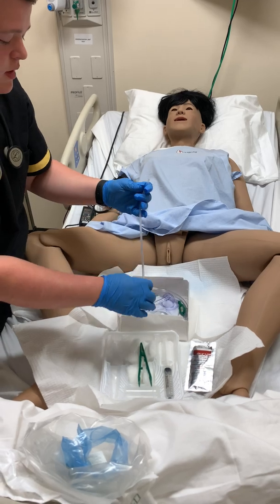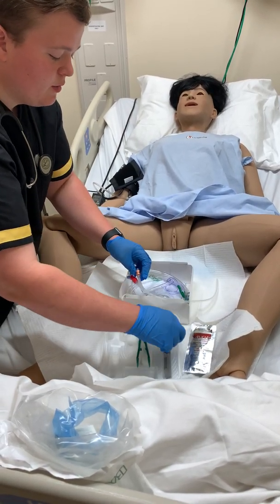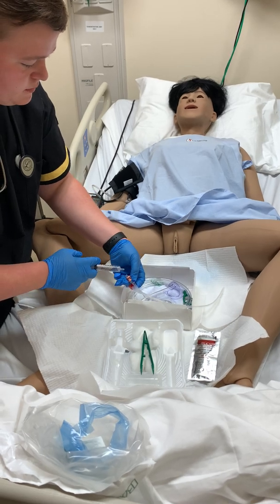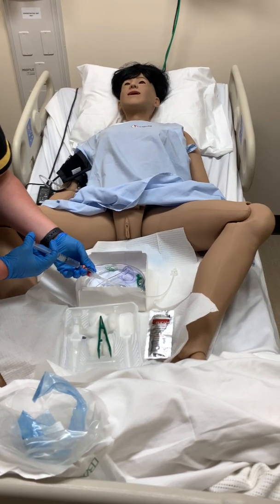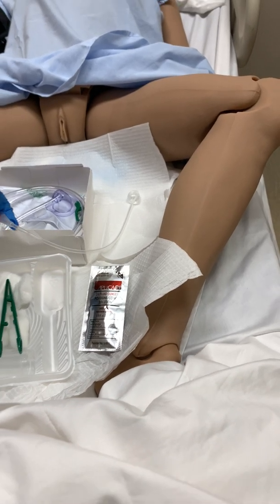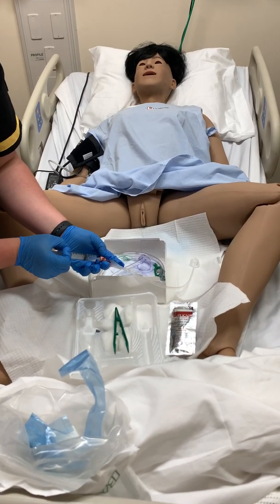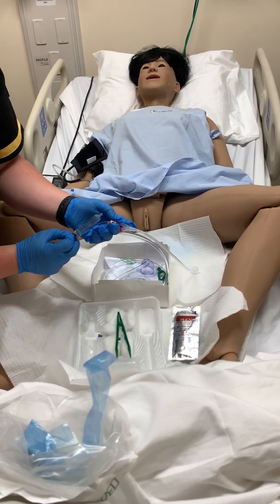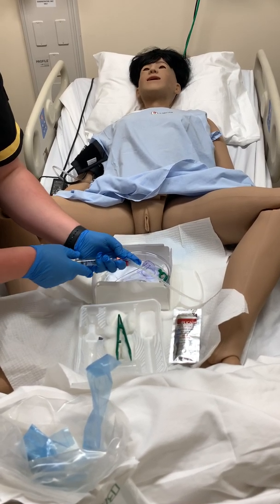And trash. Alright, so the next step, we're going to go ahead and test our balloon to make sure everything works properly before we try to insert. Alright, we'll go ahead and insert all 10 milliliters. Alright, and everything looks good, so we can go ahead and deflate the balloon.